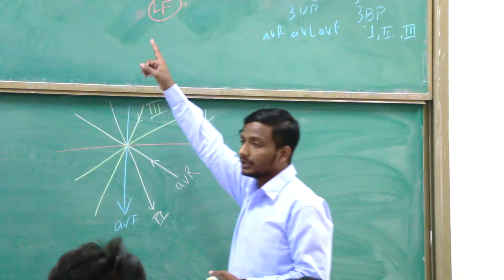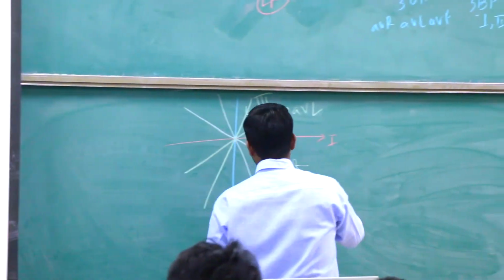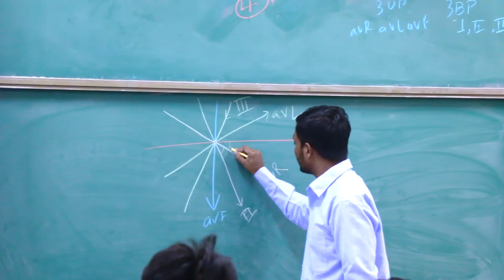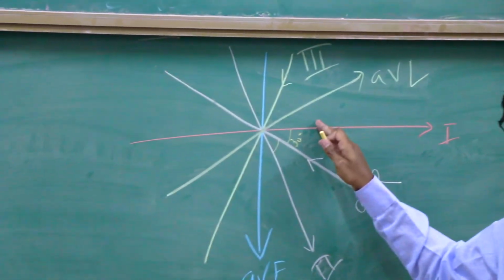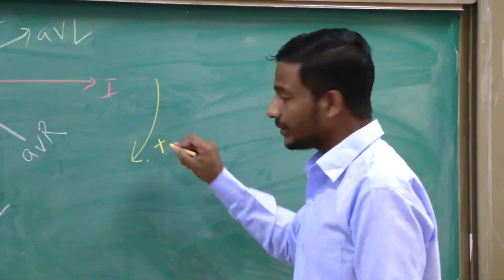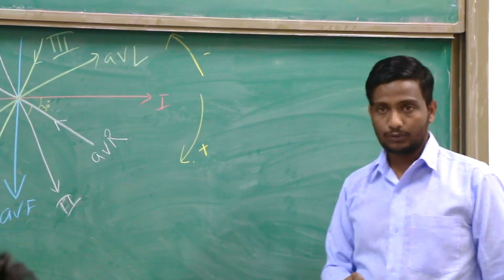What do we call this? Now we have got something called the hexaxial system. And the thing for you to remember here is that the angle between all of them is going to be how much? 30 degrees. So now we have got 30 degrees, and in this way we keep on going further. Whenever we go clockwise, we use the positive sign. And if you want to go anti-clockwise, this side you are going to use negative.